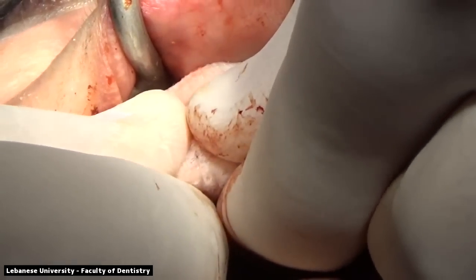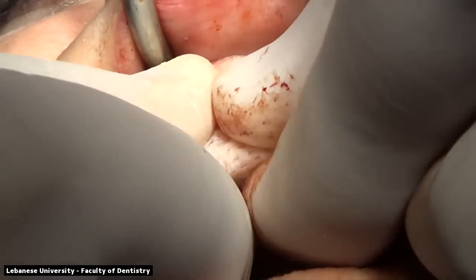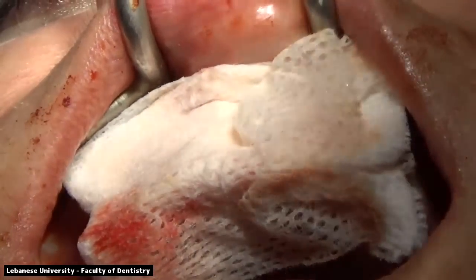Using a moist gauze, we're adapting the soft tissue, making sure that there are no gaps for the seepage of the blood.